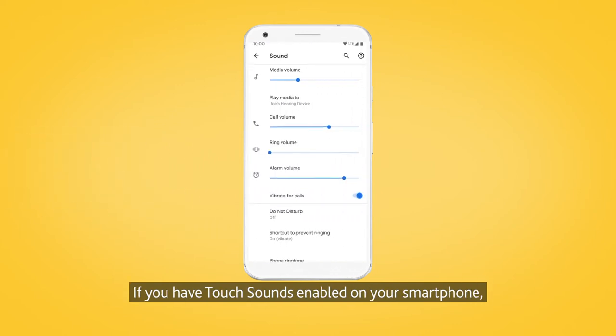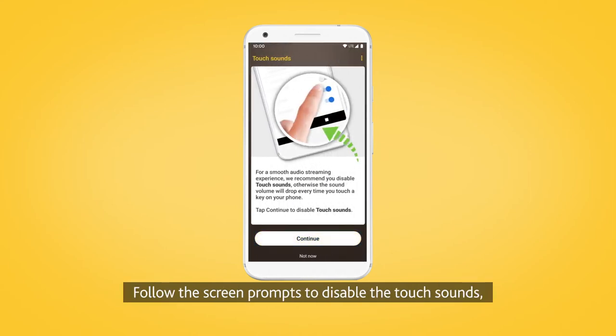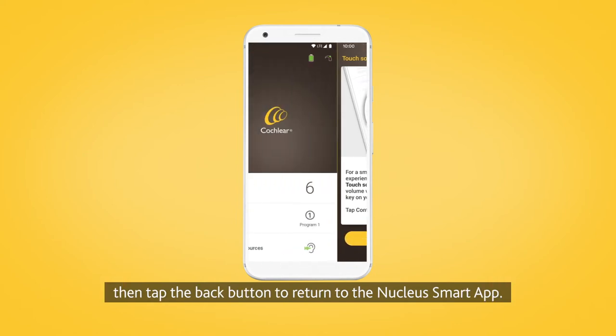If you have touch sounds enabled on your smartphone, the touch sound screen will display. Follow the screen prompts to disable the touch sounds, then tap the back button to return to the Nucleus Smart App.